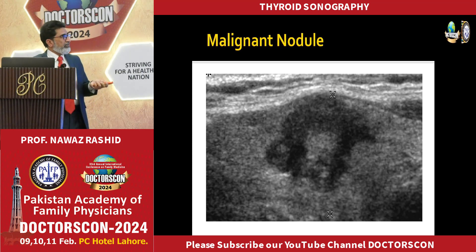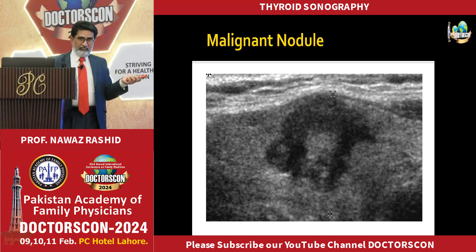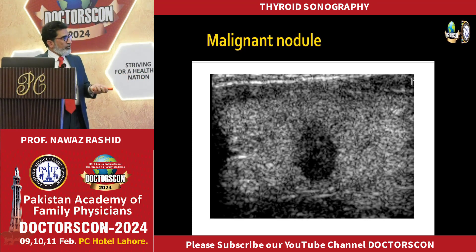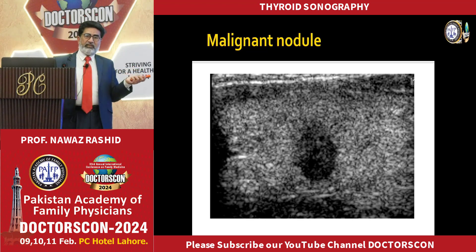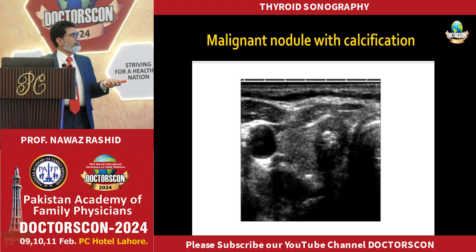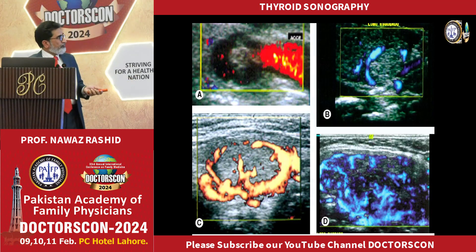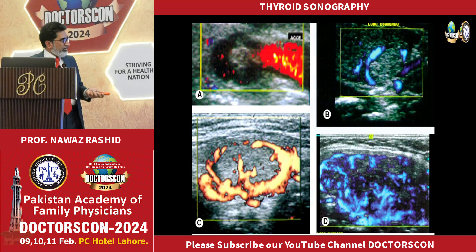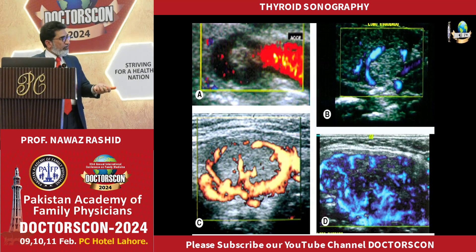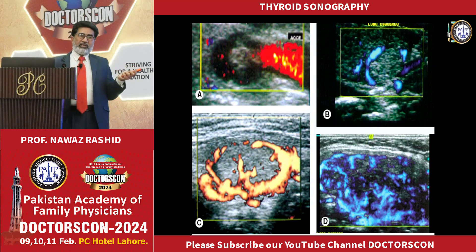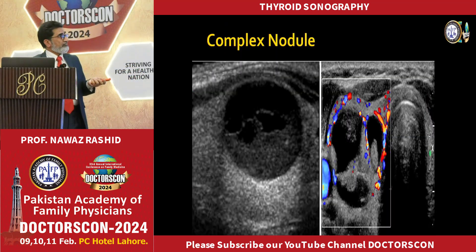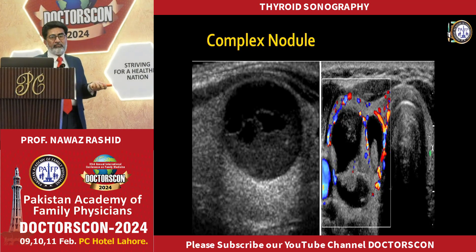This is a malignant nodule. Look at the margins — they are irregular. A malignant nodule shows peripheral and intranodular blood flow. You can see how much flow is inside and at the periphery — if you see this pattern, you have to think about malignancy. This is a complex nodule with a cystic component, solid area, and blood flow both inside and outside — this is also malignant.